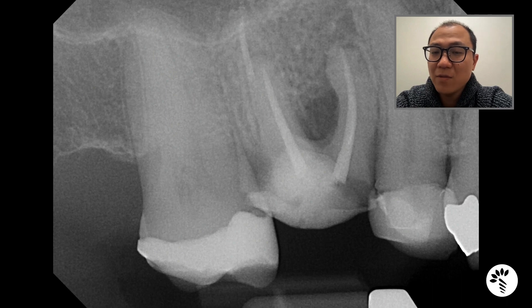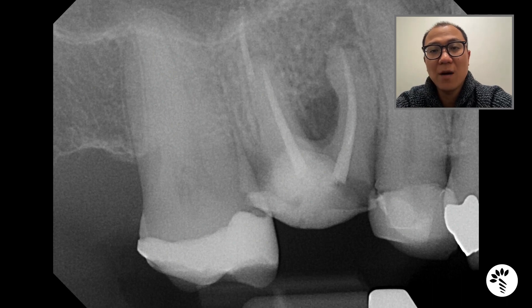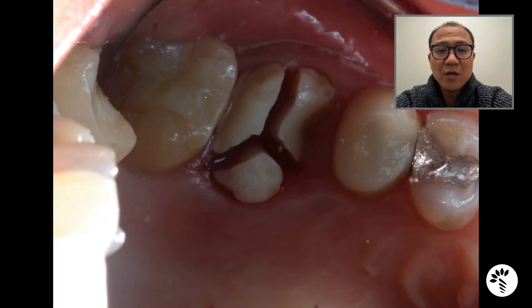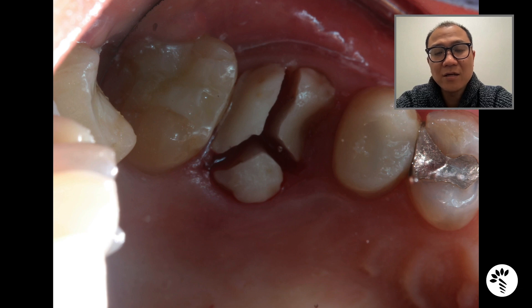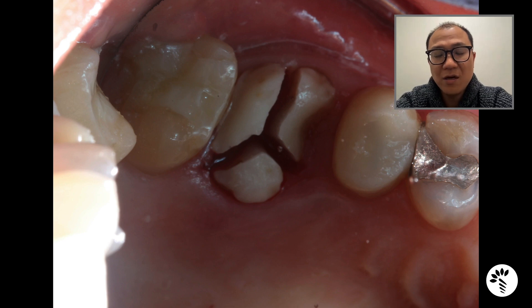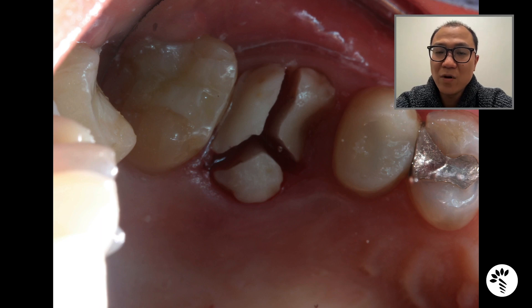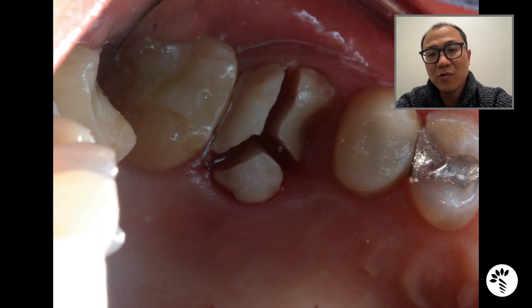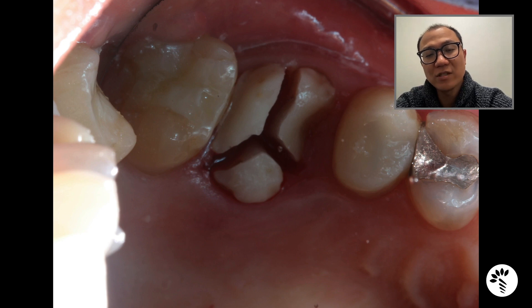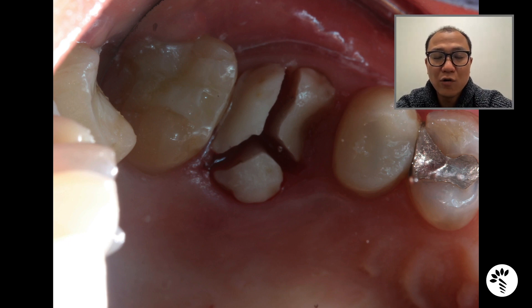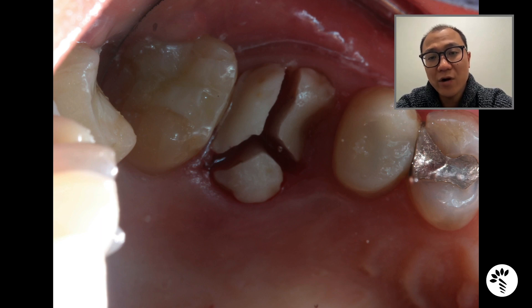I do expect a little bit of buccal bone loss preoperatively, knowing the size of the bone loss on the mesial socket. When doing an extraction, I strongly recommend sectioning the root — by doing that you can clearly preserve as much bone surrounding the tooth, and it allows you to apply less force during the extraction, which means less trauma to the tissue and alveolus, and also greater patient comfort.